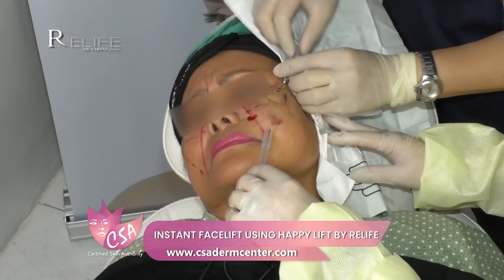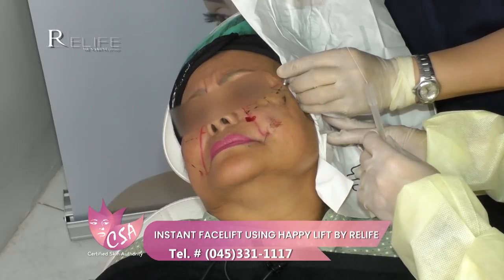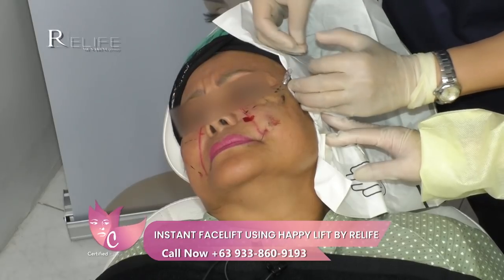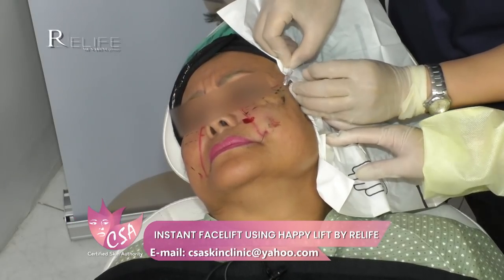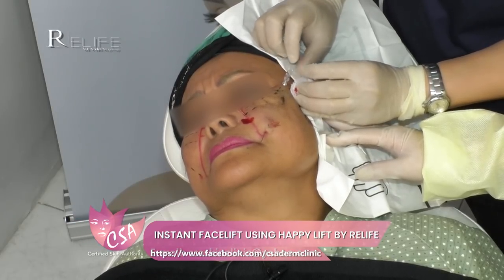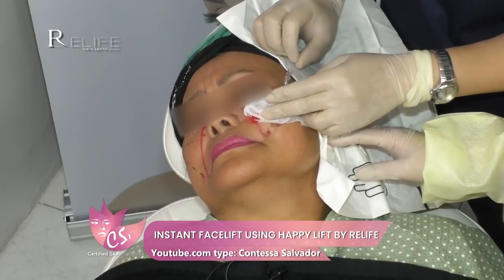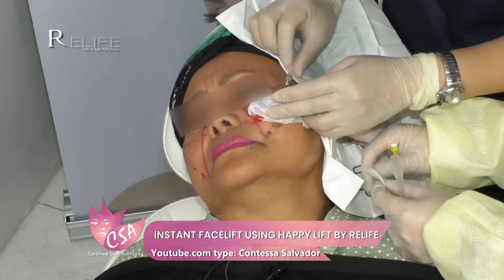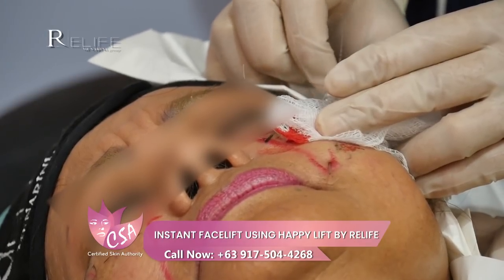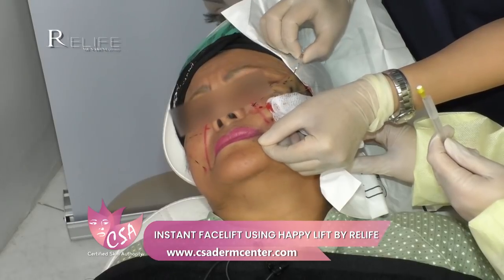It's sensitive near the mouth, but we're able to exit already. I need my third free-floating thread. It's free-floating, compared with the double needle thread demonstrated before — this one doesn't have an attached needle. There's some bleeding. We have the entry point, exit point — the third reshaping line. That's the third one done.